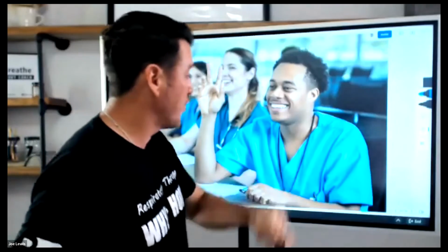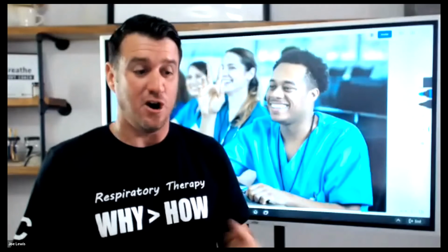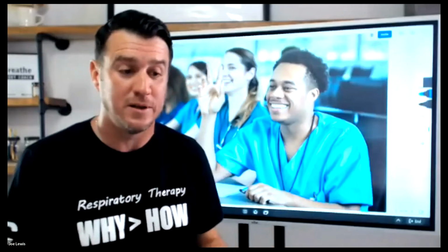Last question. We've gone through 4 of them, and here's the last one, and it's simply this. Is your patient progressing, or are they regressing? Are they getting better, or are they getting worse? Now, this is something that if you have done the previous 4 adequately, then you're going to know the answer to this. Also, if you're doing your due diligence, as I know you are, in getting your data and looking at your chart before you ever step in that room, and you're looking at your latest chest x-ray, your most recent chest x-ray, and if there's not one and we're wondering what's going on, then perhaps we need another one.